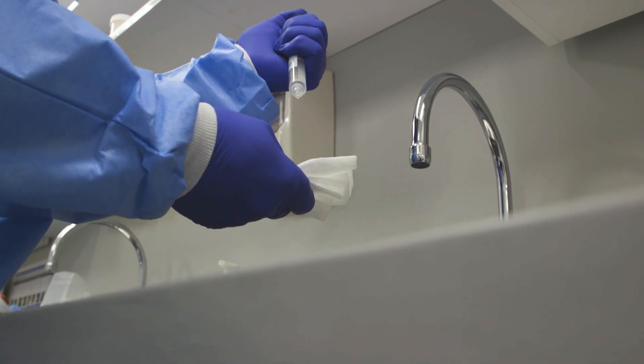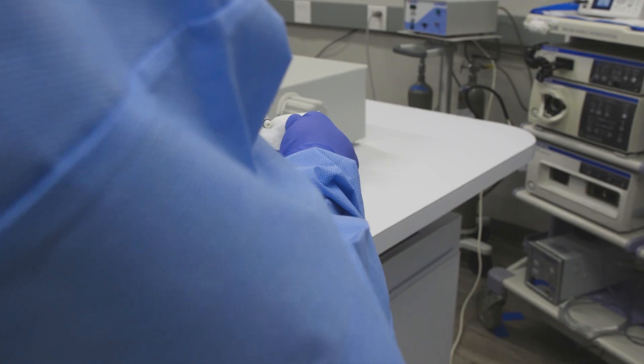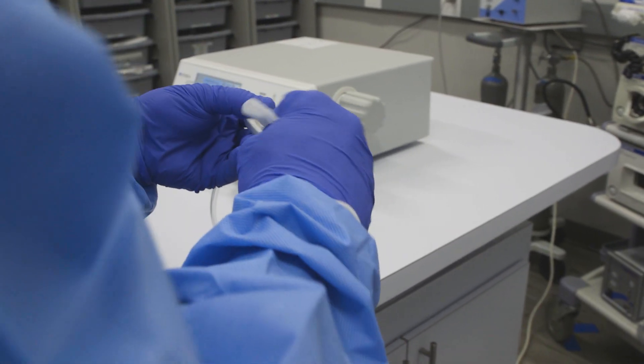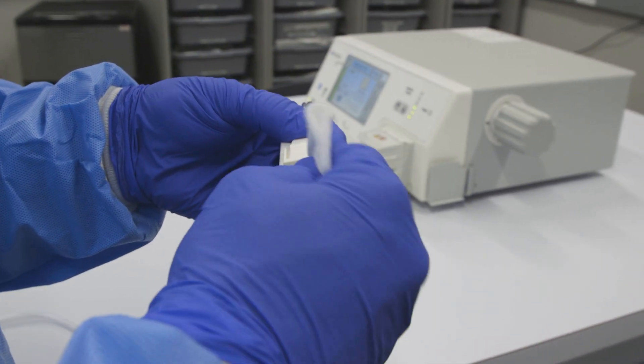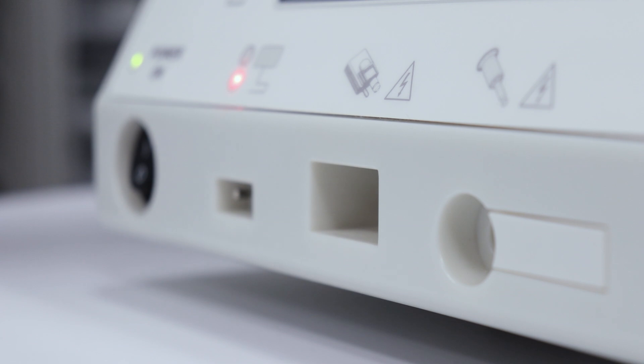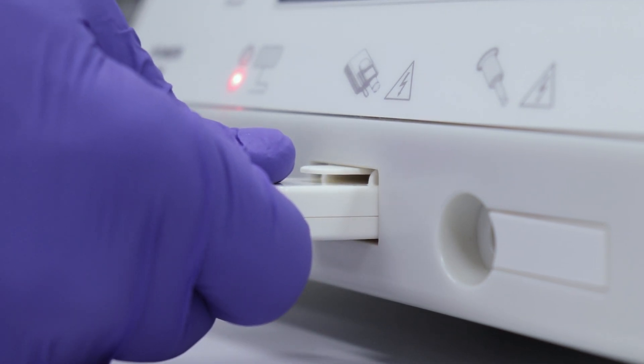For easier insertion of the ArcConnect into the GI-4000, while using gloved hands, pour a few drops of sterile water onto clean, lint-free gauze and lightly wipe around the perimeter of the black o-ring. Insert the ArcConnect into the GI-4000 by pushing in and lifting up until an audible click is heard.